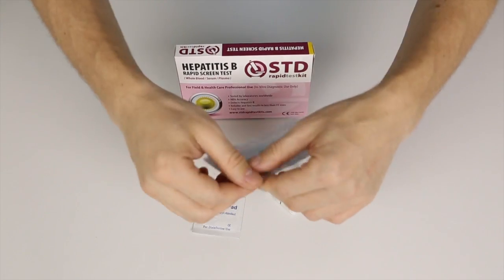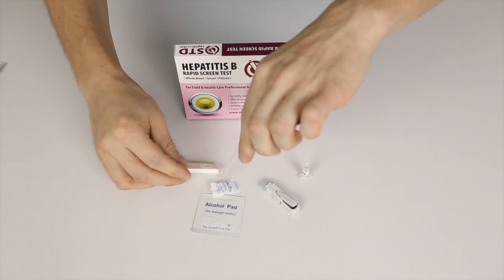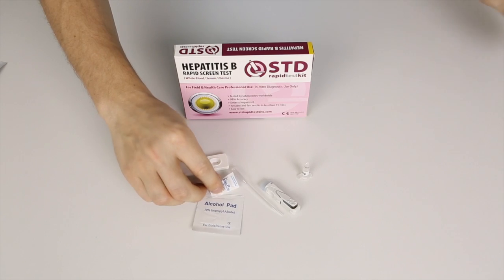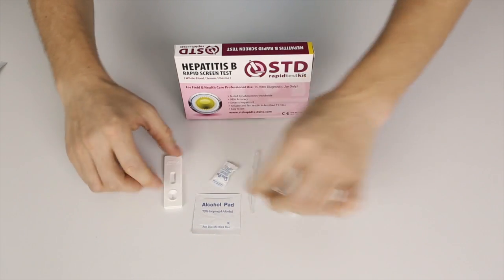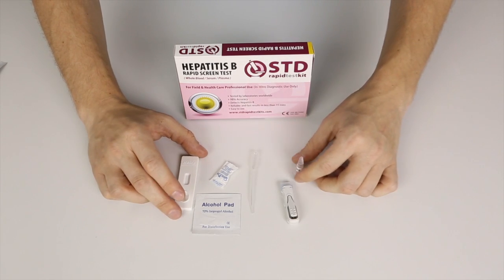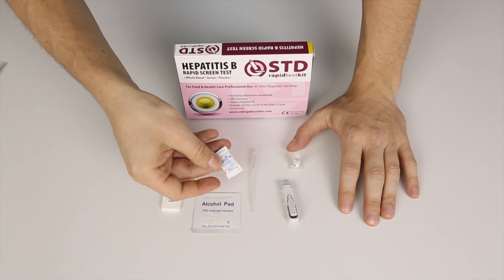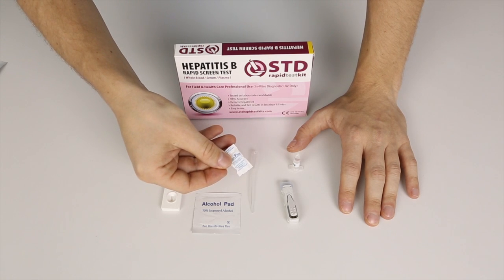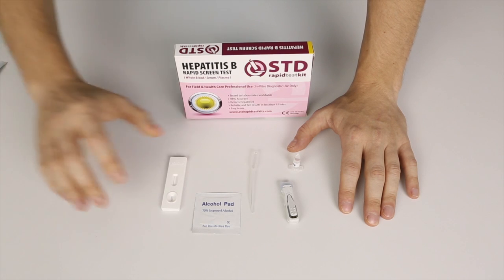I'll start off by opening the pouch containing the test cassette itself. Take it out. This is just desiccant — it's for storage purposes only. It keeps the test dry and you can just throw it away as soon as you open it.